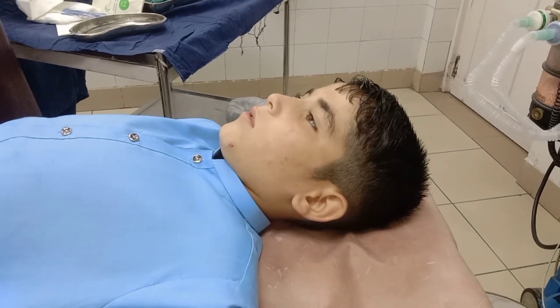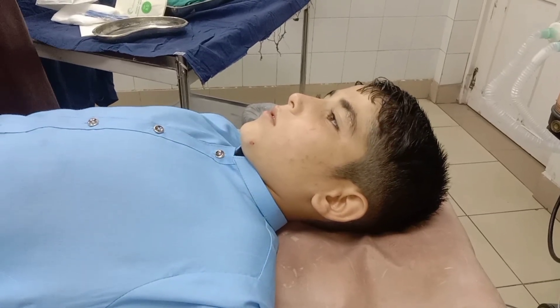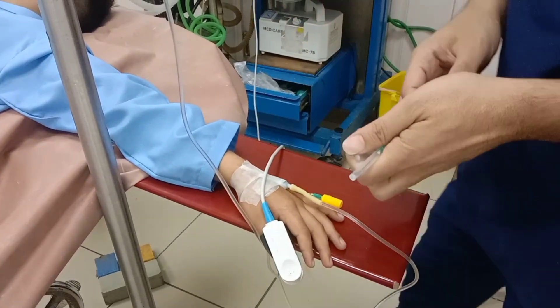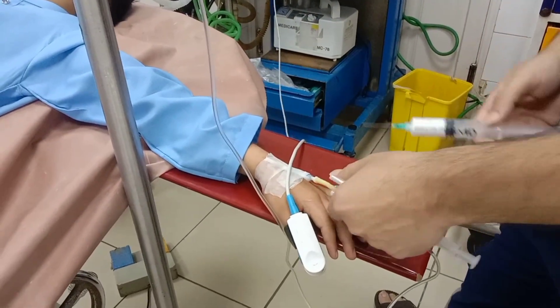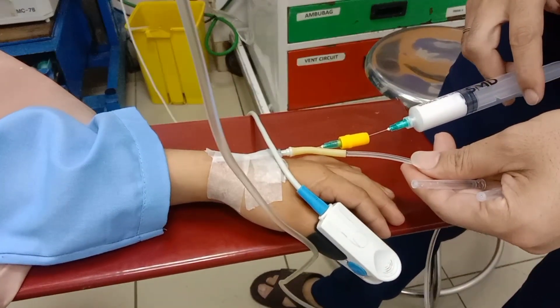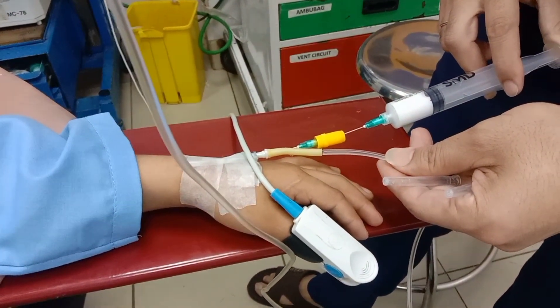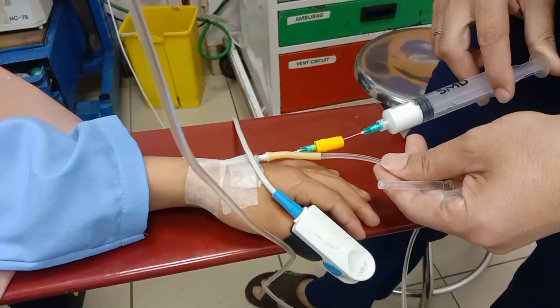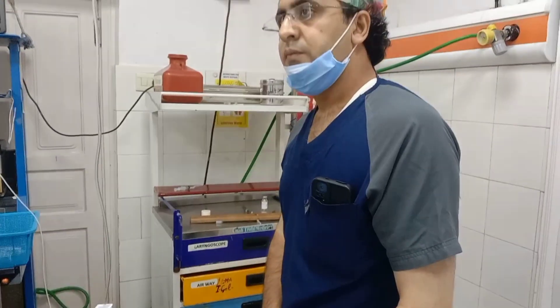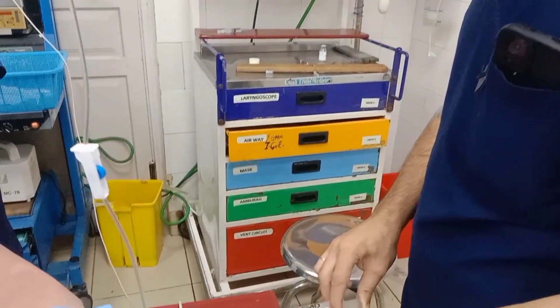For induction of anesthesia, Propofol was administered intravenously in the appropriate calculated pediatric dose. Once loss of consciousness was achieved, the patient was ventilated with 100% oxygen via face mask. Following this, a muscle relaxant, atracurium, was given to facilitate smooth intubation, along with the required premedication drugs as per the anesthesia plan. Adequate time was allowed for onset of action, and proper mask ventilation was confirmed.